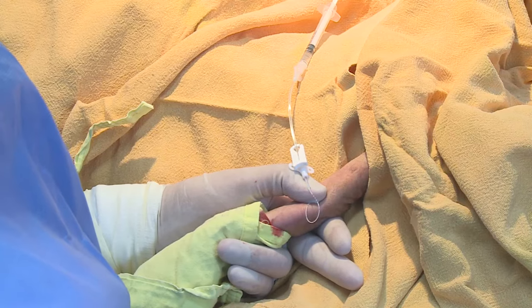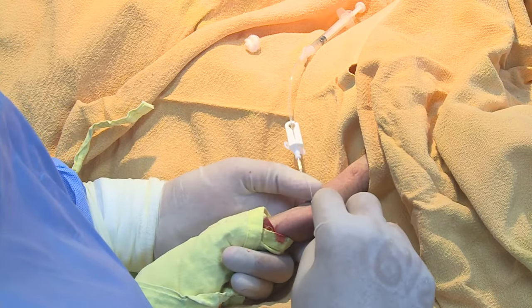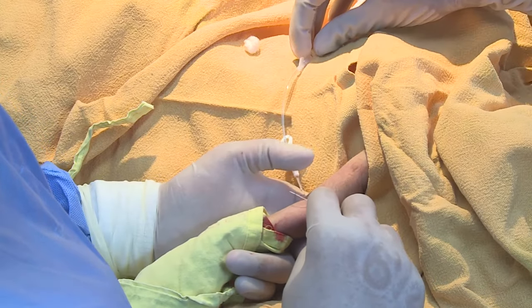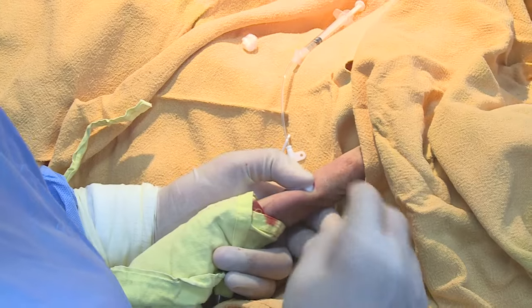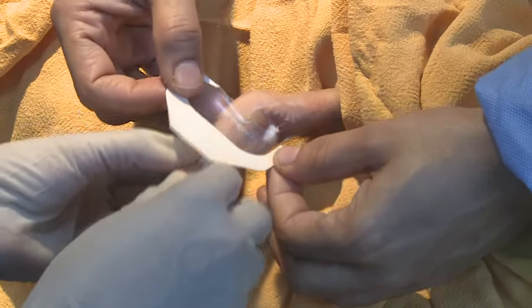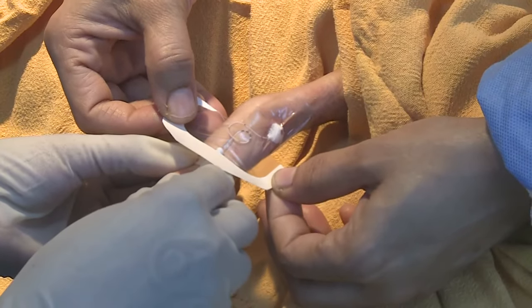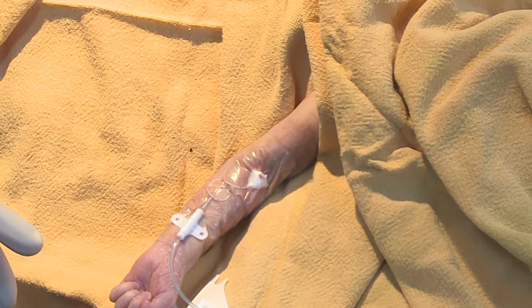When any bleeding has completely stopped, recheck the length inserted by checking the markings externally or measuring the length of the line remaining externally. Once the estimated depth is ensured, fix with transparent dressing. Check the patency by flushing the catheter with normal saline and observing free flow of blood on withdrawal.